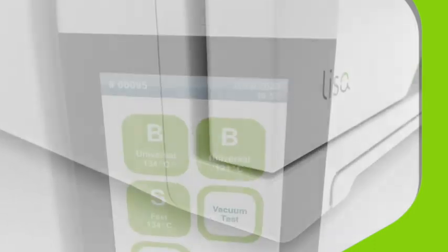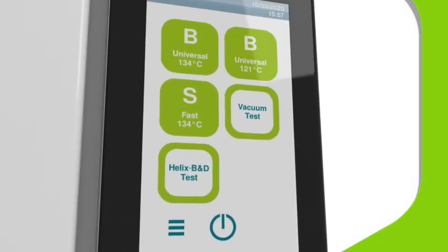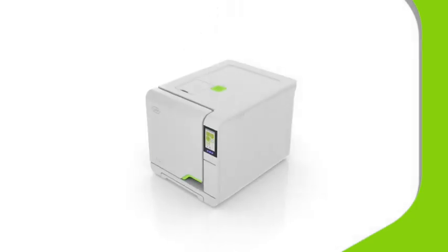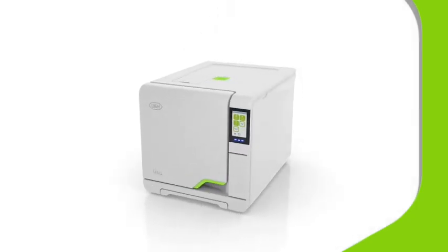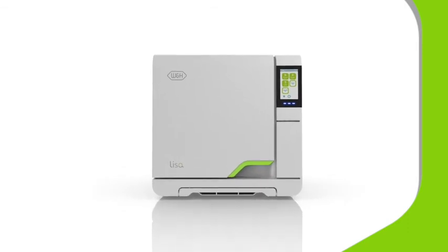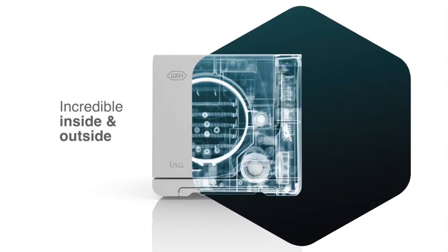Now you have met the new Lisa VA-131 vacuum sterilizer. We think you'll agree that it is outstanding in all the categories that matter. For a Type B vacuum sterilizer that processes to the highest standards of safety and hygiene in modern dental practice, look no further. Lisa — incredible, inside and out.